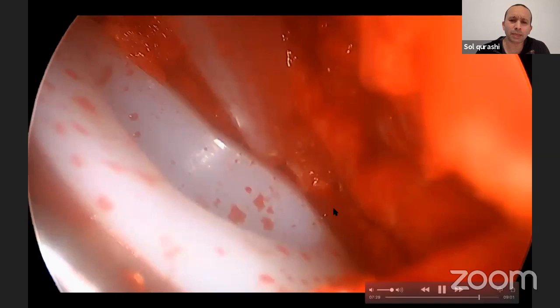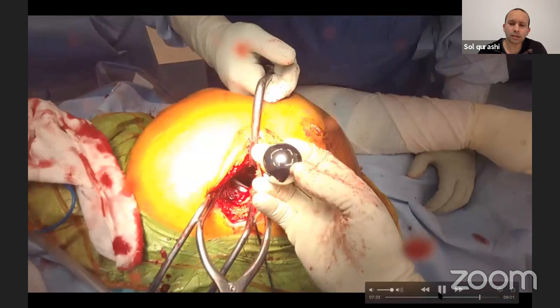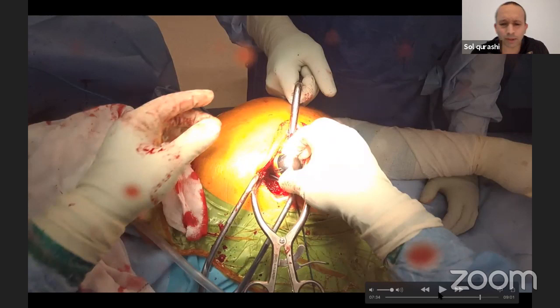So now this is the other trick, unique thing about SuperPath, the in situ reduction. And some people criticize it for various reasons of taper corrosion and impaction or this and that. So far, I've been pretty lucky. I haven't had a problem.